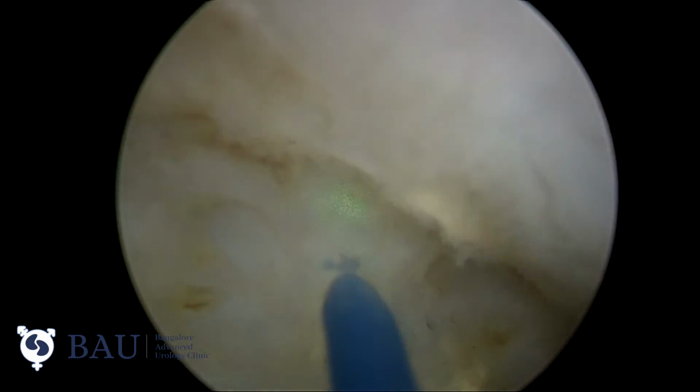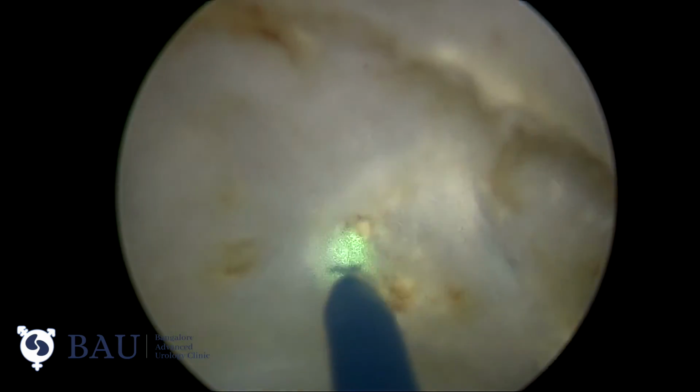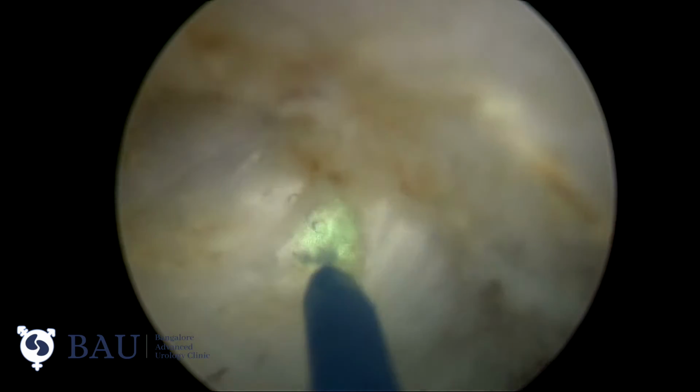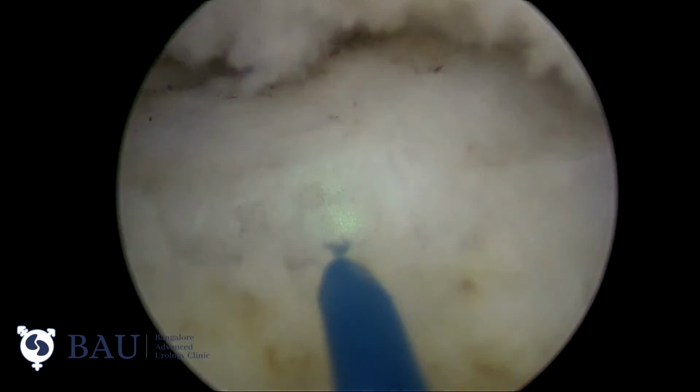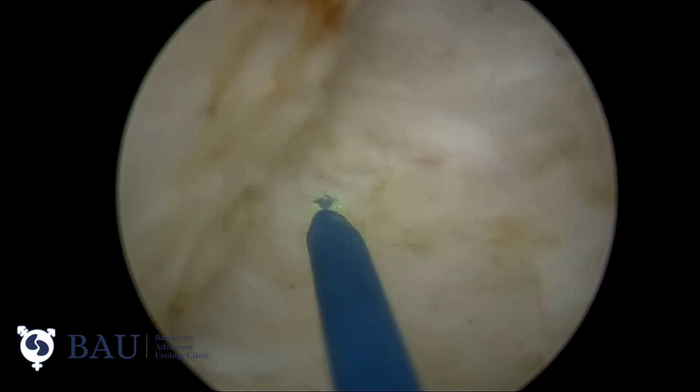We have to be extremely careful in this part of dissection. The risk of undermining, the risk of injuring the ureteric orifice, or opening up a major bleeder are very high in this zone.